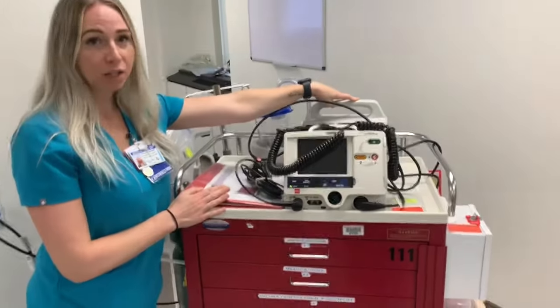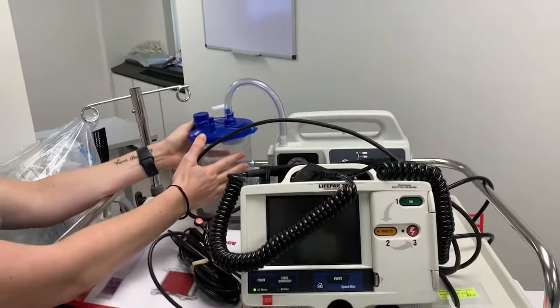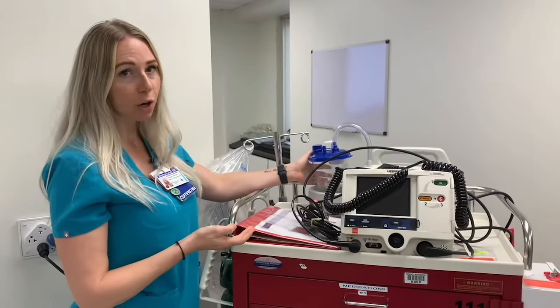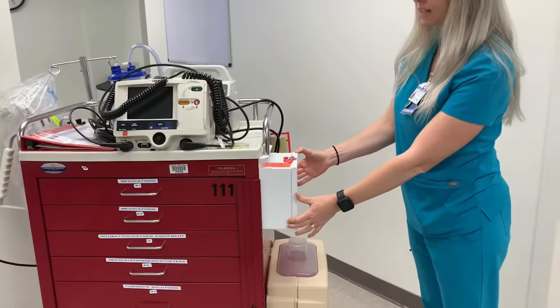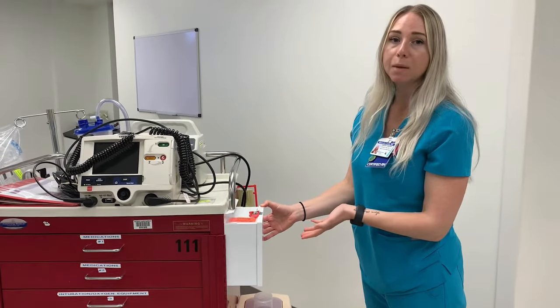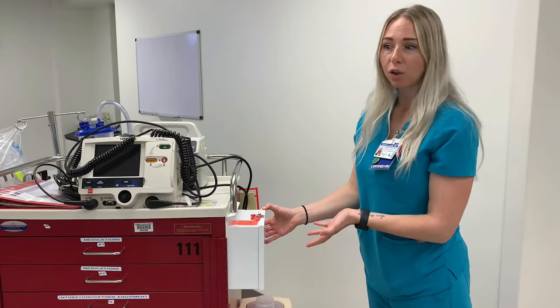Behind here we have our suction — this is the machine that creates the suction — and then you need to have a canister on the side, and this tube should be hooked up so that it's fairly ready to go whenever you enter the patient's room. On the other side we have our box that contains our rocuronium, which is a paralytic medication that may be needed when we go to intubate the patient during the code if necessary.